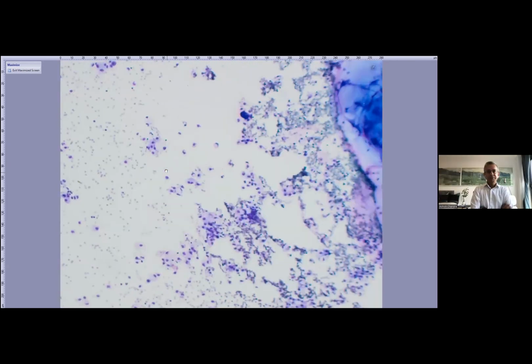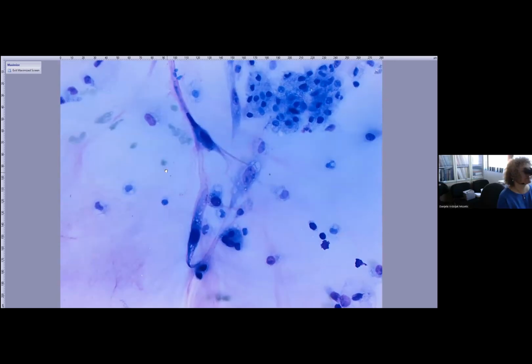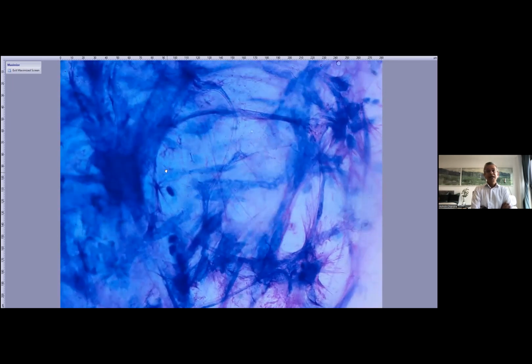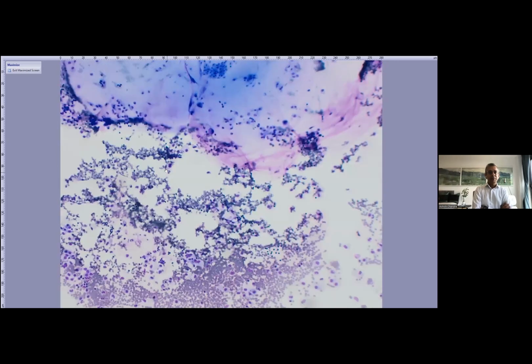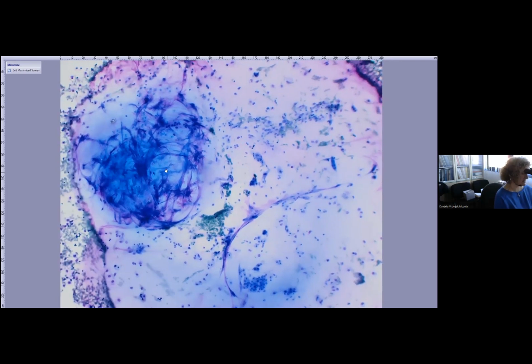Yeah, I mean, like a lake. Yes, absolutely. I think if you see mucin, you should look hard for the cells, because the cells themselves could be quite bland, couldn't they? If it's a mucinous adenocarcinoma. And in fact, one of the categories and conditions in the international system was if you just see mucin, even in the absence of pleomorphic cells, you should raise the possibility of pseudomyxoma from either a GI or gynae primary, because mucin in the peritoneal cavity is an abnormal finding. Yes, and this is the case, such as you described.